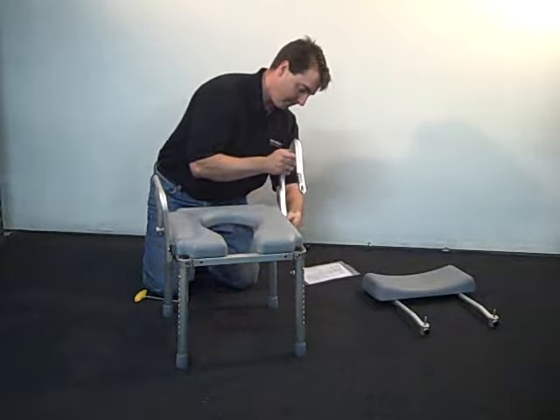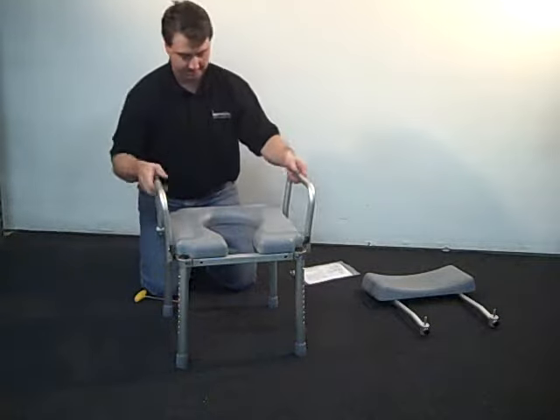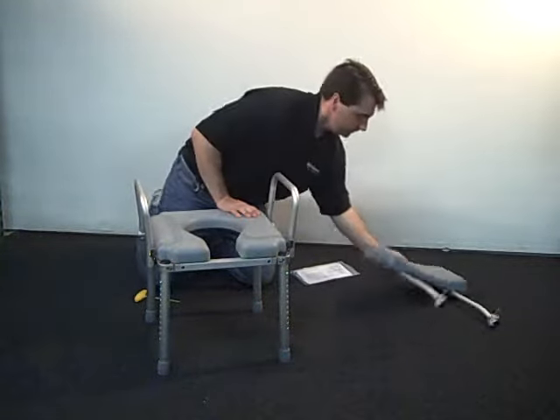Then lower down the arm until the latch engages around the black plastic ball attached to either side of the frame.